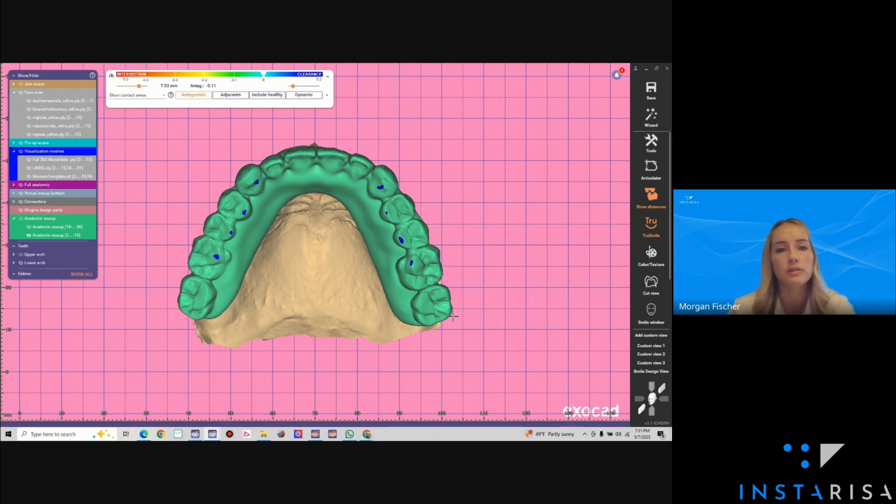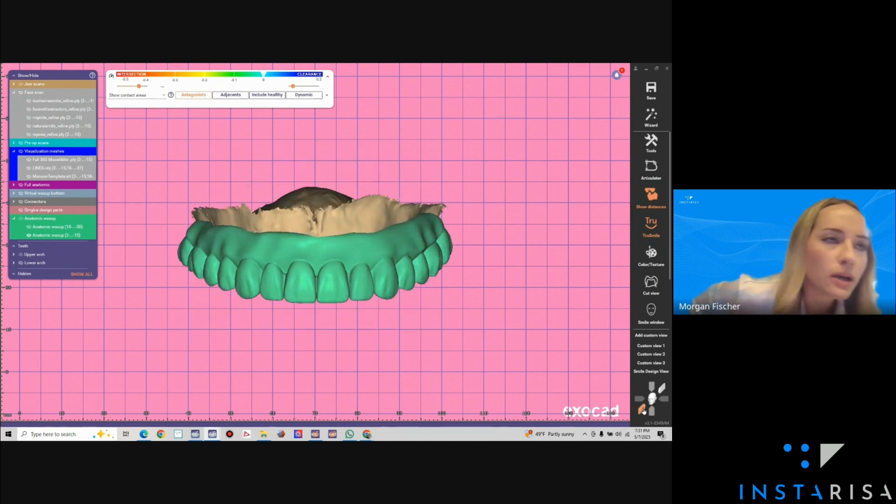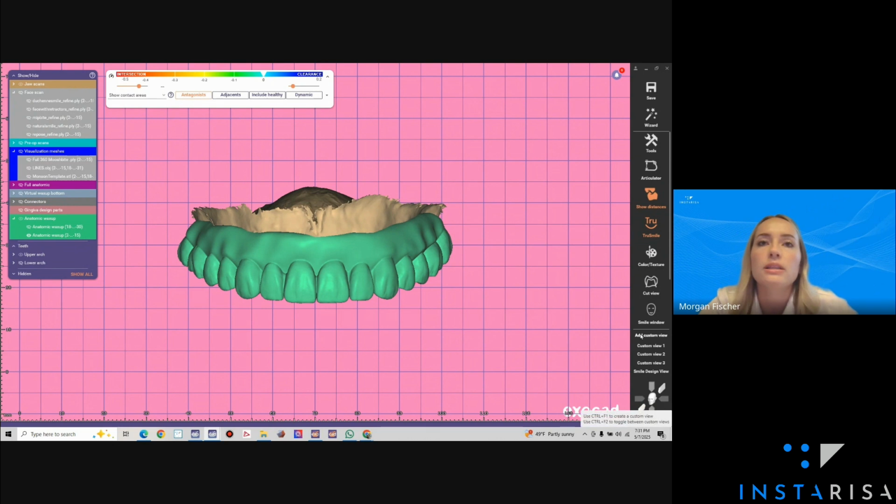And the reason that we really like, especially on the day of surgery, for 7 through 10 to be out of contact is so that if the bite was off and we start to equilibrate the patient in over their healing period, if we start off with 7 through 10 out of contact, once we're equilibrating them in to that position, by the time we're finished, we'll probably have light occlusion on 7 through 10 there.